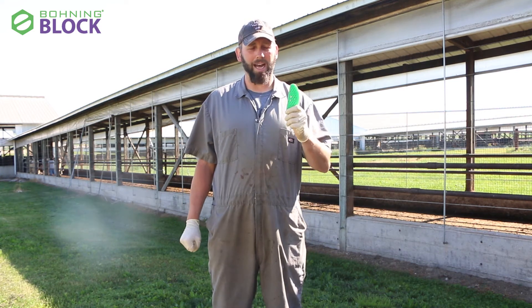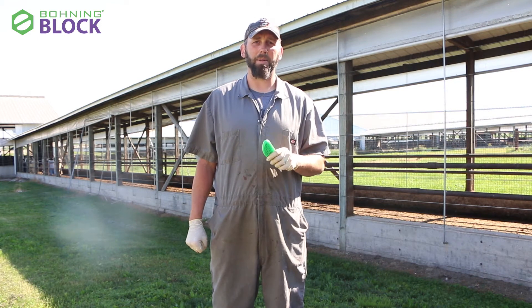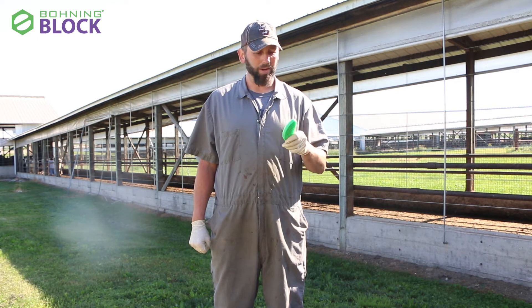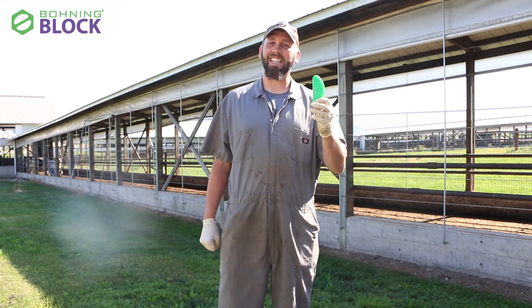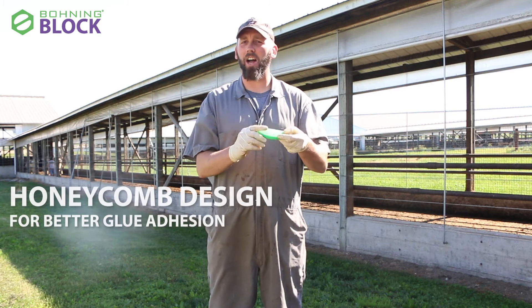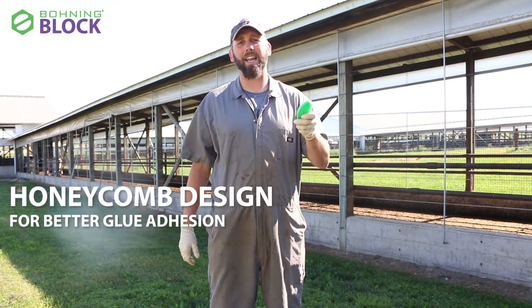So I put my cousin Bob to the test and he said we can make something that will be effective and efficient for you guys. So here it is — the Bohning Block. Some of the cool features on this block are the honeycomb pattern, engineered so that glue will adhere, stay, and hold the block on.